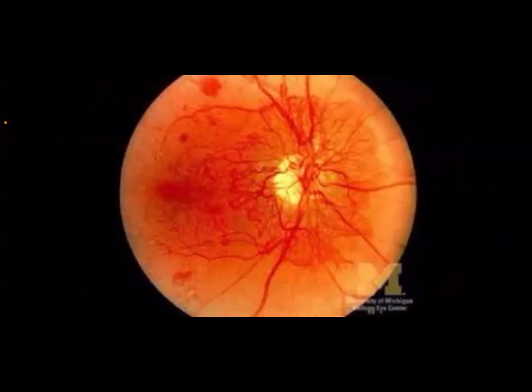extensive neovascularization. And by the way, it is very important, if you find neovascularization, to mention that this patient, instead of diabetic retinopathy, has proliferative diabetic retinopathy. The difference between retinopathy and proliferative retinopathy is the new vessel formation, neovascularization. And here it is for urgent referral to an ophthalmologist for pan-retinal photocoagulation, laser therapy.